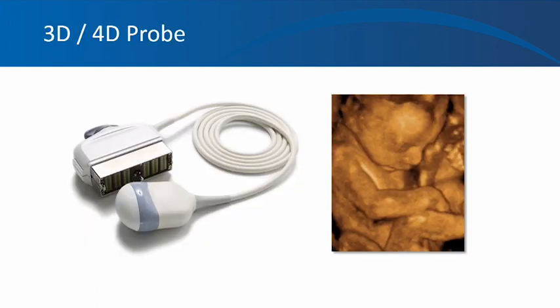Three-dimensional and four-dimensional probe. So these are wideband curved transducers that are used to obtain 2D, 3D, and 4D images for abdominal obstetrics and gynecologic imaging, and you can get pretty pictures of babies using them. They're of less utility and more fun at this time, but they're likely to have a role in transplant renal ultrasound in the future to evaluate vascular anastomosis.